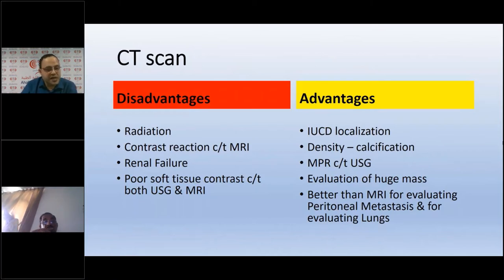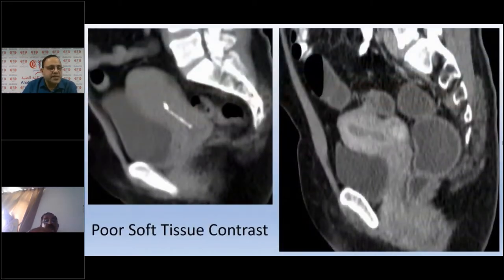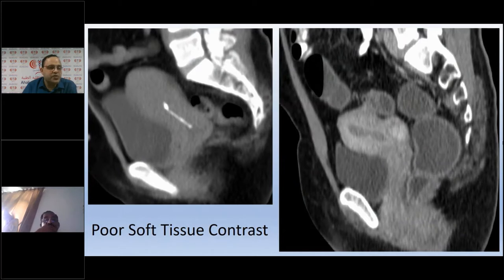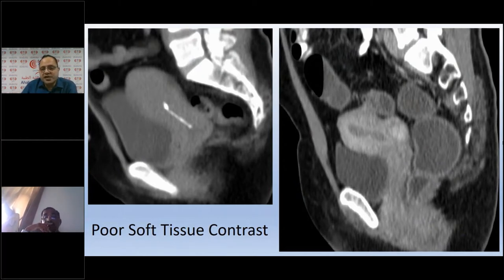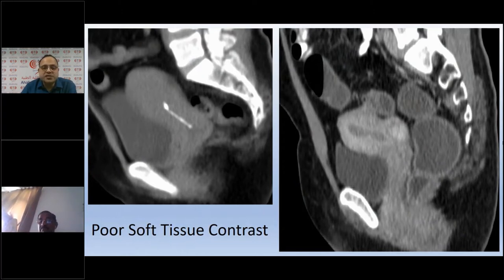To illustrate poor soft tissue contrast: on a plain CT scan, the uterus looks like just a lump of soft tissue — we cannot differentiate endometrium, junctional zone, or myometrium, making pathology identification difficult. Even with contrast, we can somewhat separate endometrium from myometrium, but small lesions like endometrial polyps, endometrial carcinomas, or small myometrial lesions are still difficult to detect. That is the key limitation of CT scan — poor soft tissue contrast.